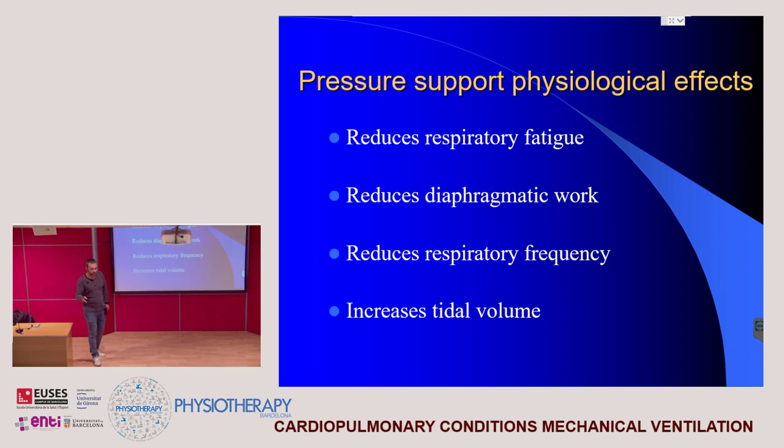We need to increase the effort of the diaphragm little by little. So that is probably the most important objective of pressure support. Obviously, if the diaphragm is working badly, the respiratory frequency will increase and will also lead to fatigue. So these are things that go together or are very close.